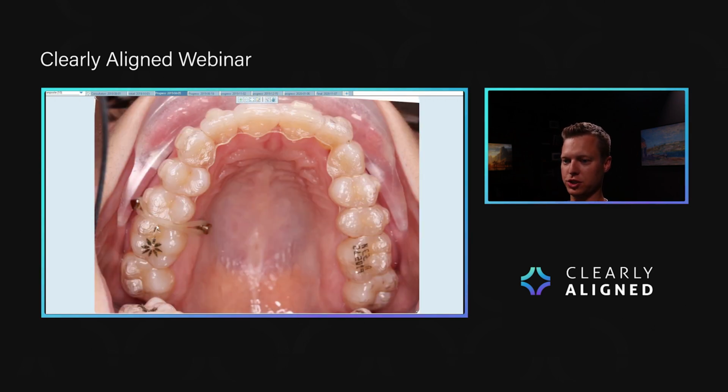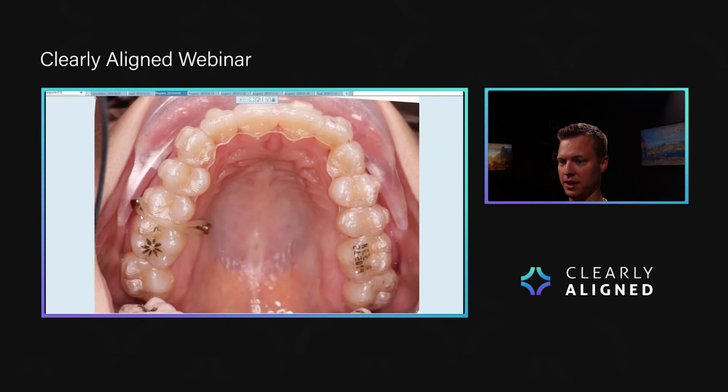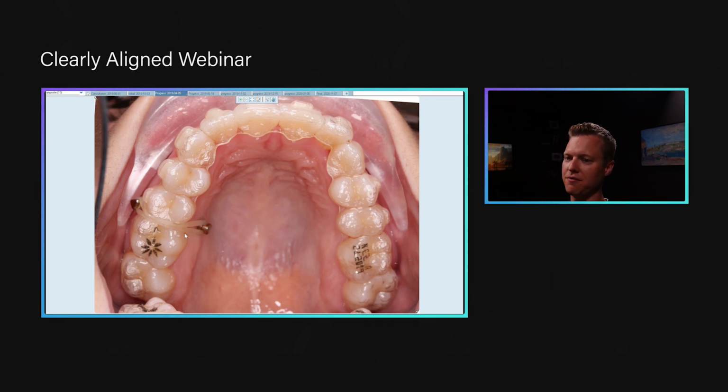Another series of photos just showing partway through treatment. This is mid-progress. You can see how that lateral incisor has started to rotate nicely. Here's the elastic hooking on again. Now it's important to know that this patient needs to change the elastics 5 to 7 times a day. So when they wake up in the morning, new elastics. At breakfast, at lunch, if they have a snack in the afternoon, at dinner, before they go to bed. Every time that they're taking their trays in or out, a new elastic goes in.